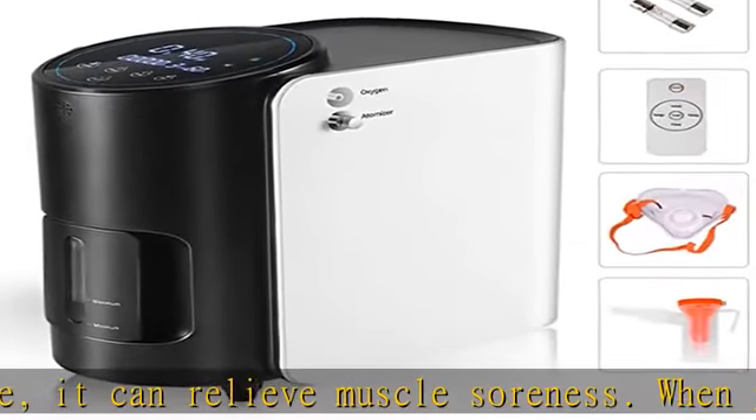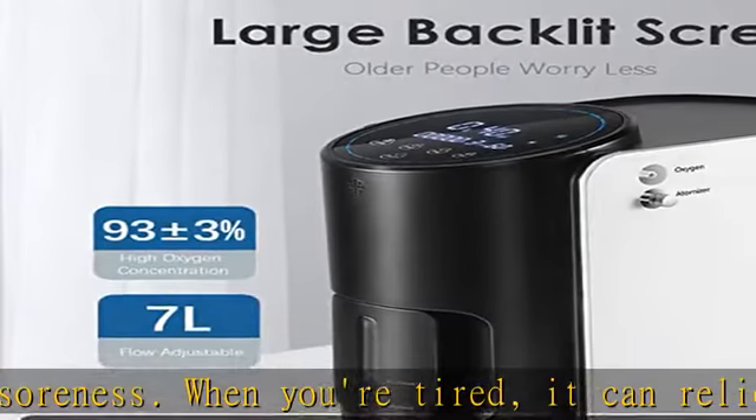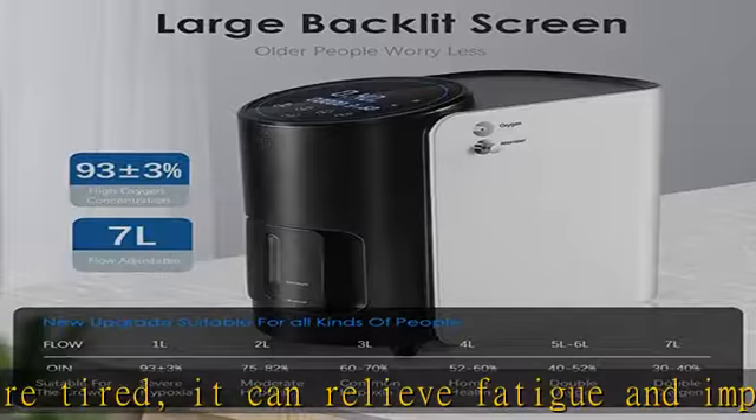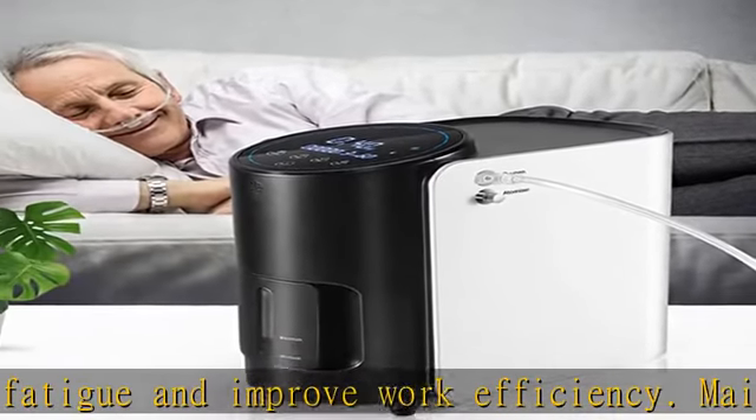Mainly for home use. Intelligent design with full touchscreen buttons. Continuous working or timing — the item has a timing function, set the time within 8 hours. Lower noise: 42 dB silent.